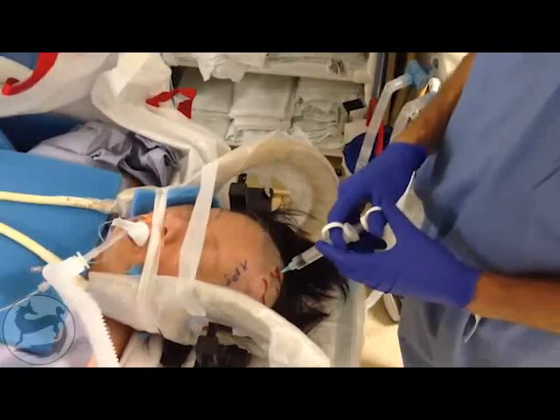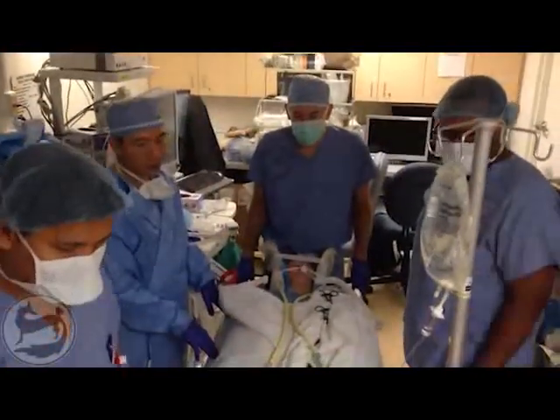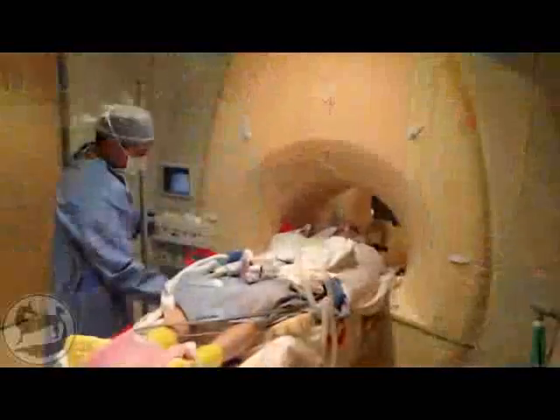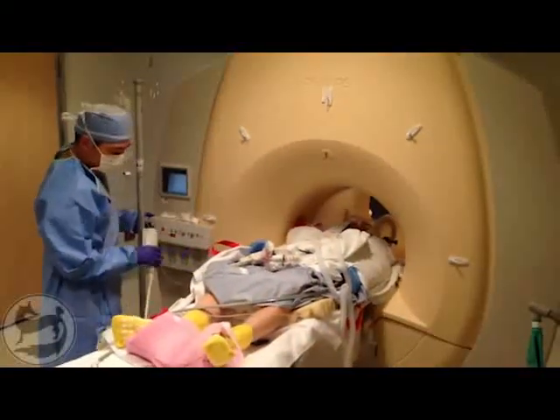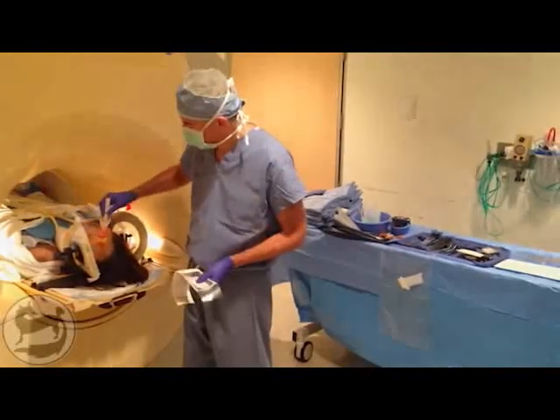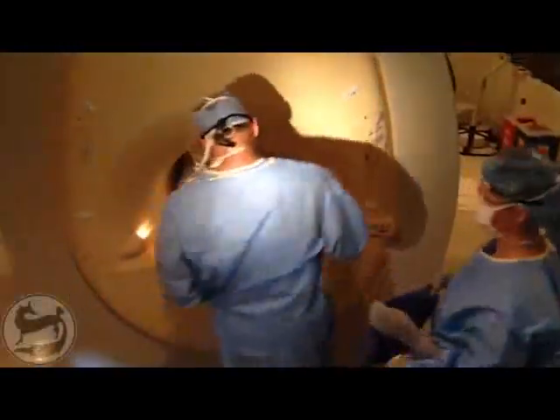After intubation, pinning and shaving, local is injected. The MRI checklist is reviewed, as is the surgical table. The patient's gurney is moved into the scanner and moved to the surgical position at the back of the bore, where the area is prepped and draped.